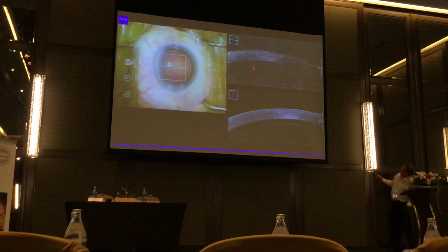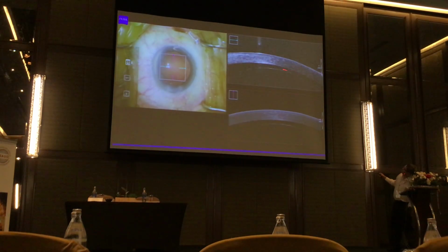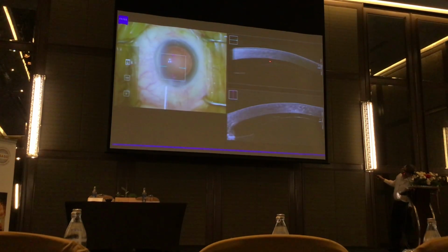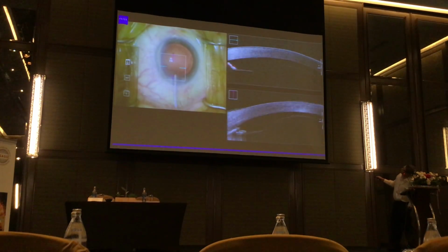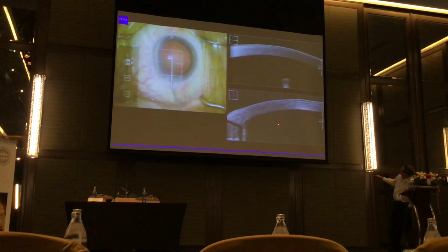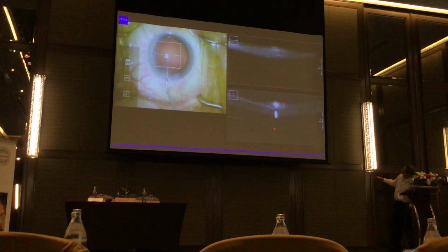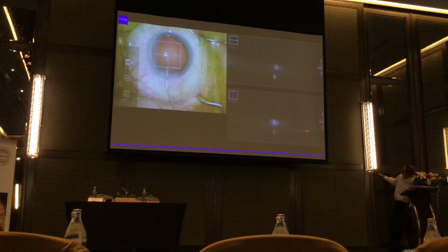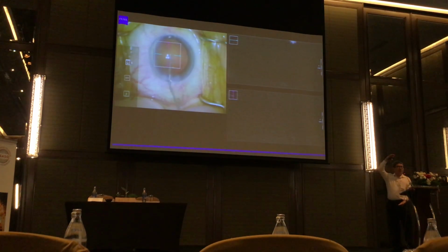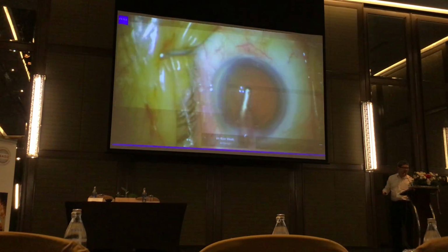Here's another one where you see after removing the instrument, the posterior capsule is way up there, not so bad. Here I'm going to show you when I put the IA back in, how much it deepens by. Or I think I'm putting in OVD. So when I inject the OVD here, see the gap's getting bigger and bigger, and that line is no longer there because it's gone deeper and deeper. And you'll see the posterior capsule now appearing way back there. So the excursion of your posterior capsule is enormous. In radial tears, it's bad news. This excursion is bad news for the vitreous movement and vitreous traction on your retina as well.